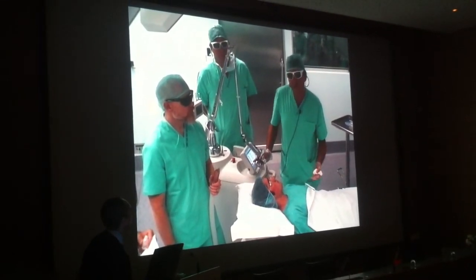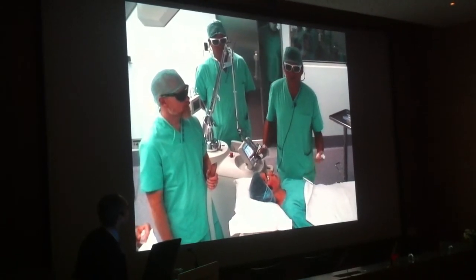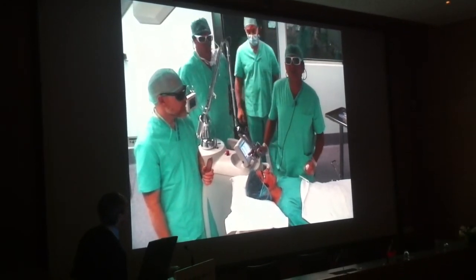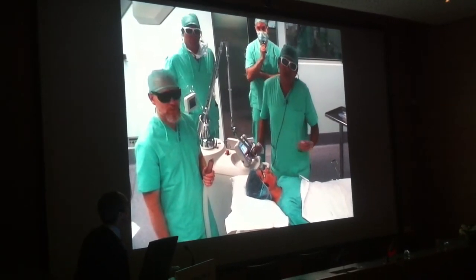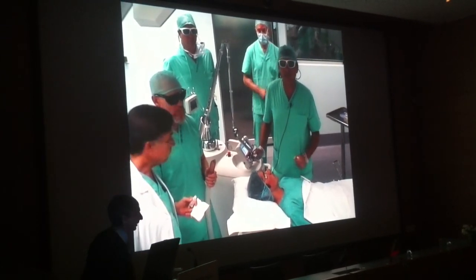And let's remember that sometimes looking for too much tightening all the time just exposes us to the risk of complications, sometimes we should also remember that we can insert some volume and we don't have to do everything with the lasers. In this way, we'll improve safety and efficacy and work by diagnosis and not just pushing every machine to the limit. Thank you for listening to me.